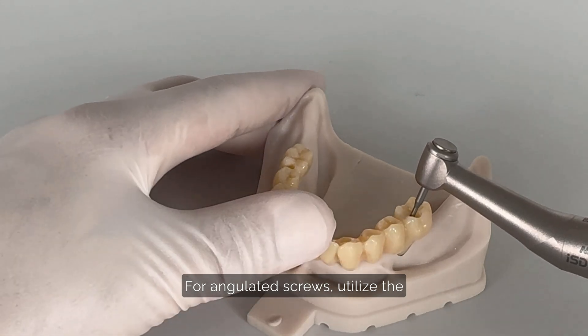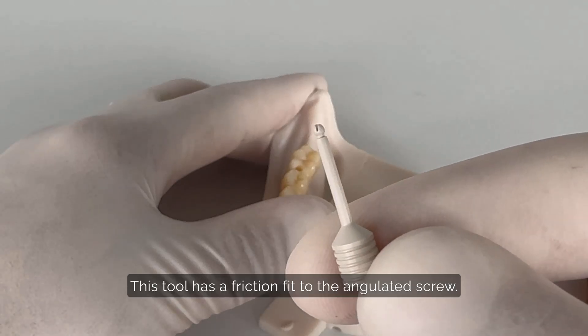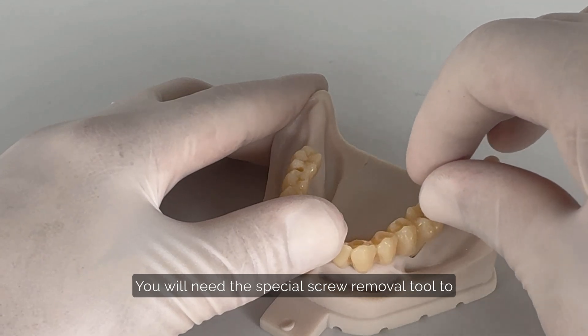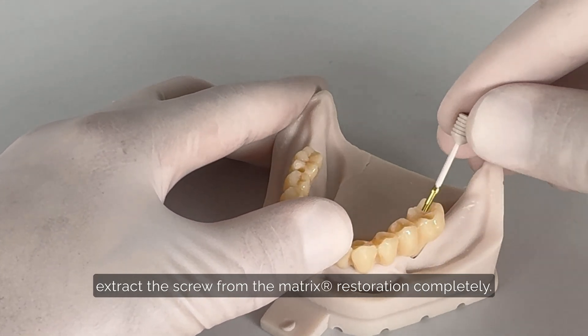For angulated screws, utilize the specialized angulated screw removal tool. This tool has a friction fit to the angulated screw. You will need the special screw removal tool to extract the screw from the matrix restoration completely.